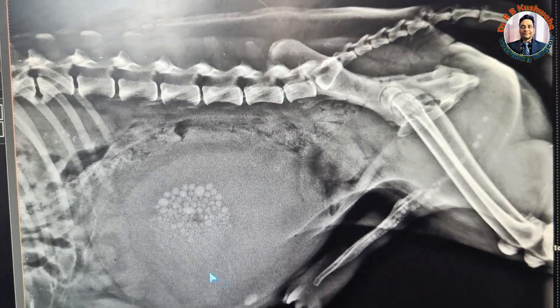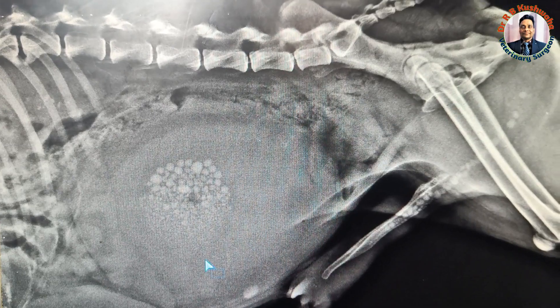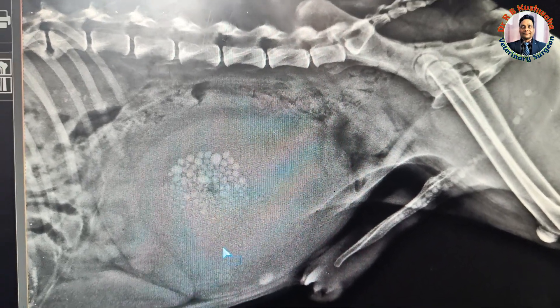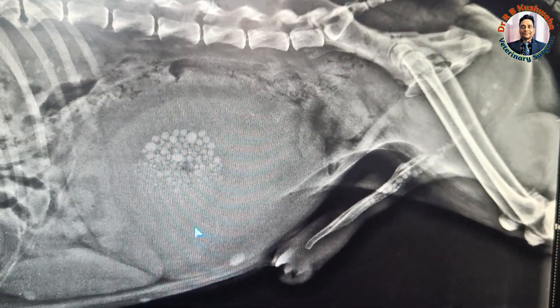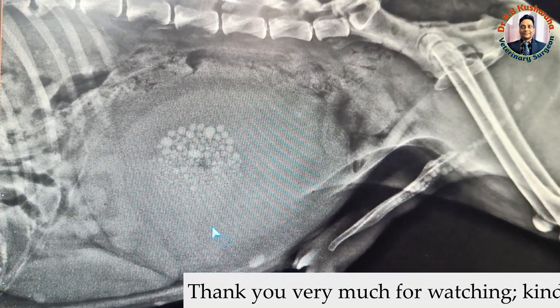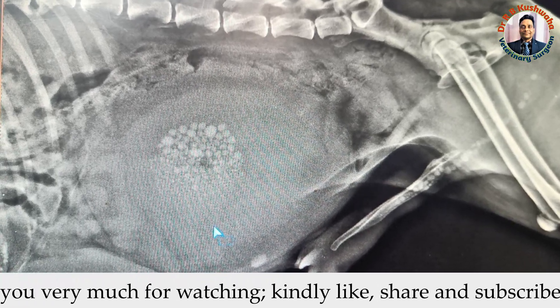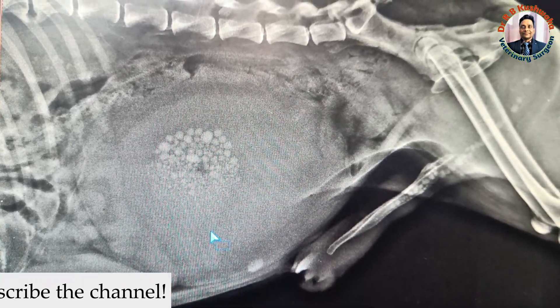So if you see such a radiograph, it is definitely a case of urethrocystic calculi. Thank you very much for watching this video, and if you liked it, please share it with your friends.